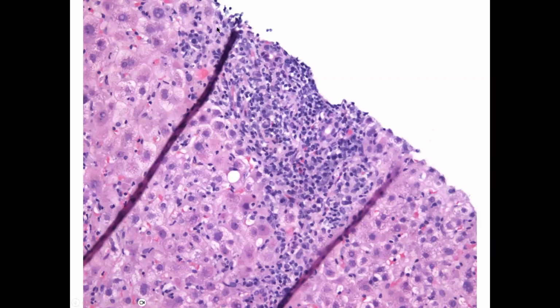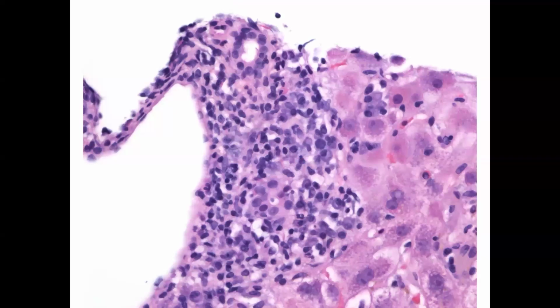So here on higher power, we can see that in the portal tract, and I know this is a portal tract because I can see a little bile duct here, and this might be a small portion of the portal vein being cut off here on the edge. So it looks like there's some portal-based inflammation here. We can take a look at the cell type in a moment. Here on higher power, we see, oh my goodness, there are tons of plasma cells in here. From your medical school or college histology, you learned that plasma cells have the eccentric nucleus here. So these are all plasma cells here.